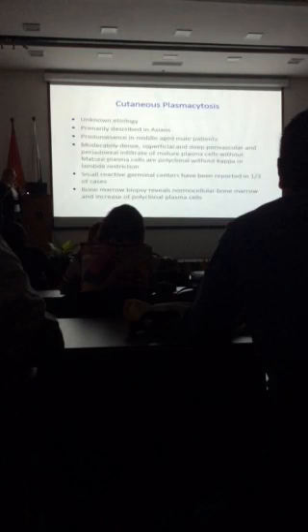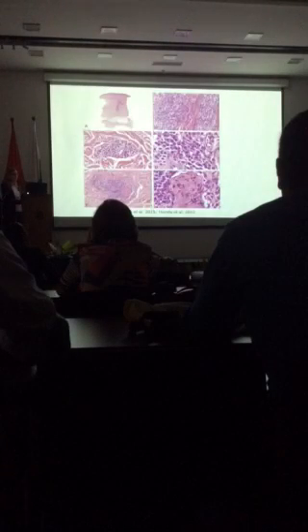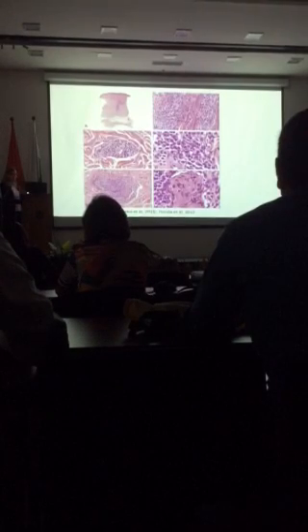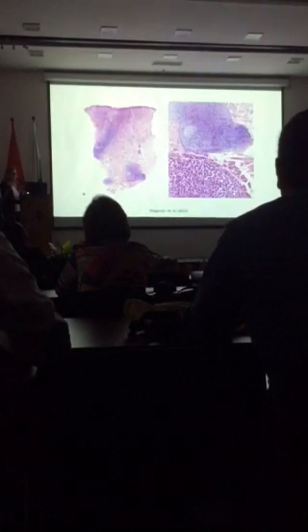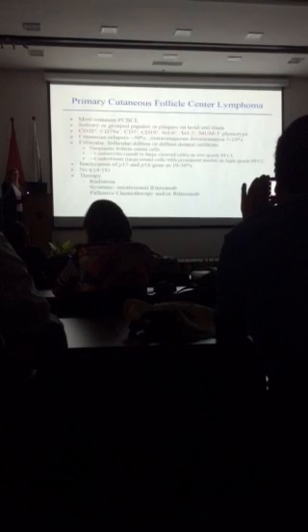The etiology is not known, but it's assumed that interleukin-6 in the skin is a factor that attracts the plasma cells. When you do a biopsy, you find mature plasma cells predominantly localized around blood vessels. And they're polytypic, so you do not find any IgH restriction, or light or heavy chain restriction.